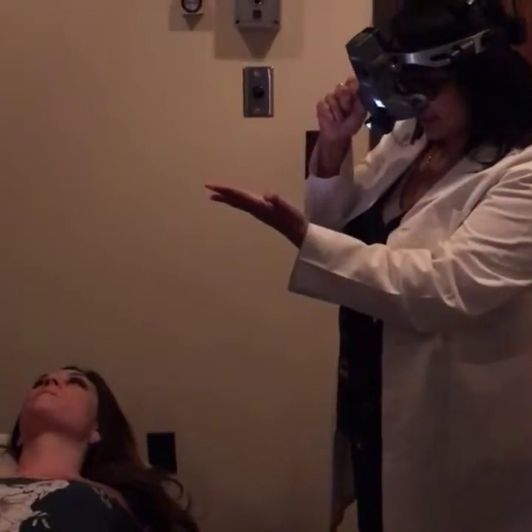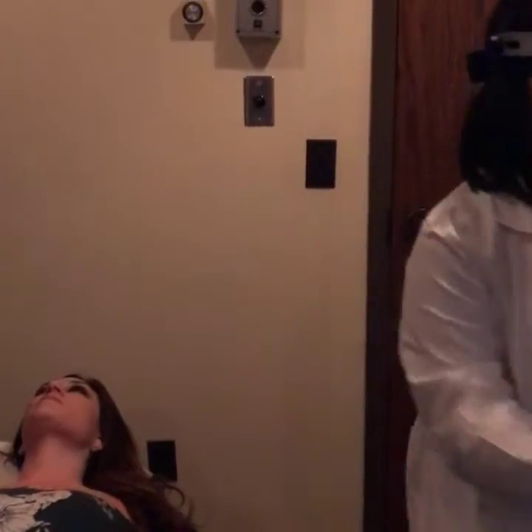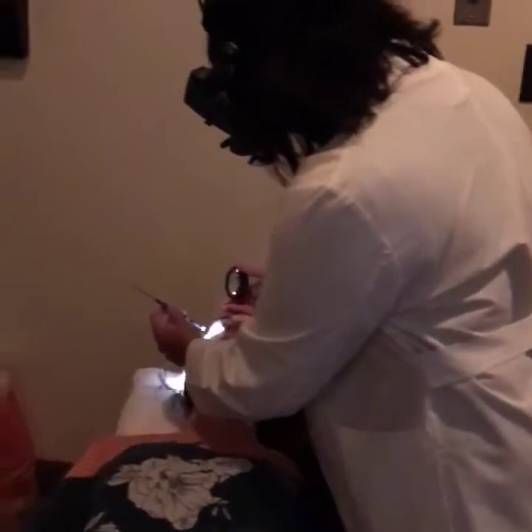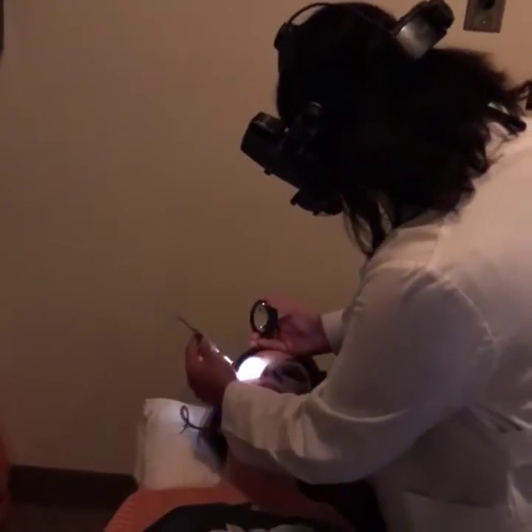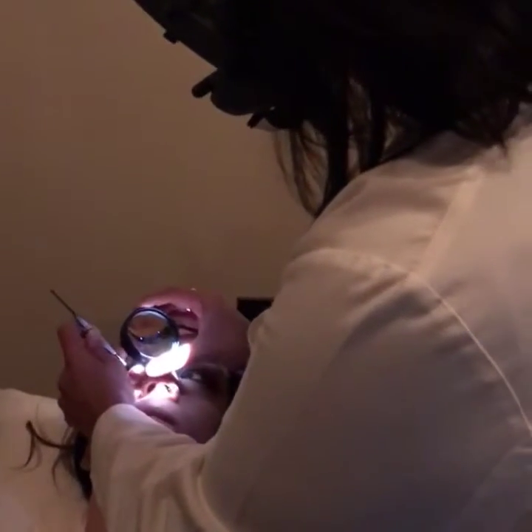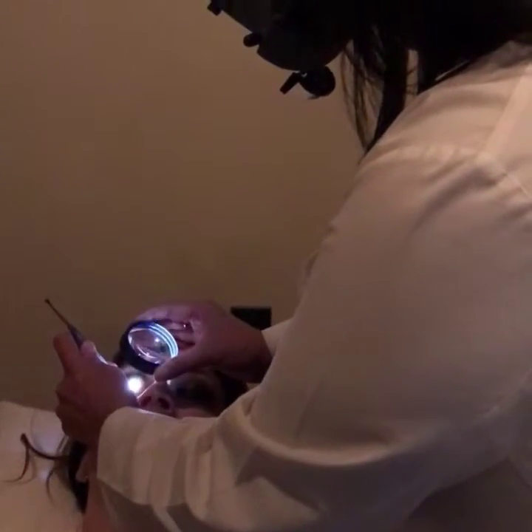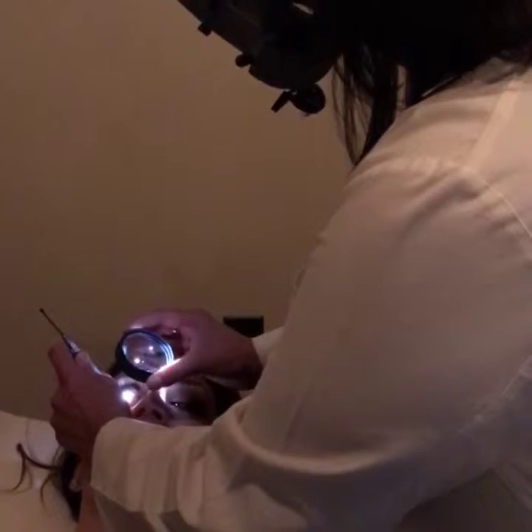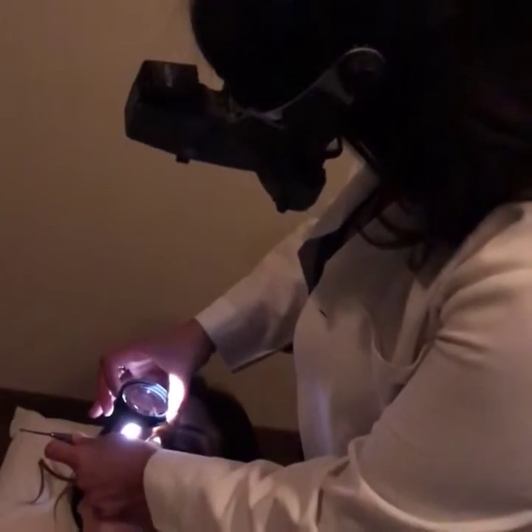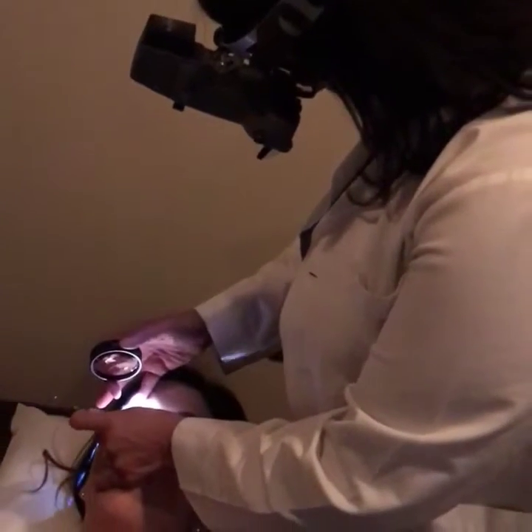This is what allows us to see all the way to the base of the retina where it's attached to a structure called the ora. Look down — you're going to feel a little pressure on your eyelid. Look up and to the right, now straight over to the right, now down and to the right. This is called scleral depression — it's like something from outer space, but it allows us to see all of the attachments of the retina to the base of the eye.